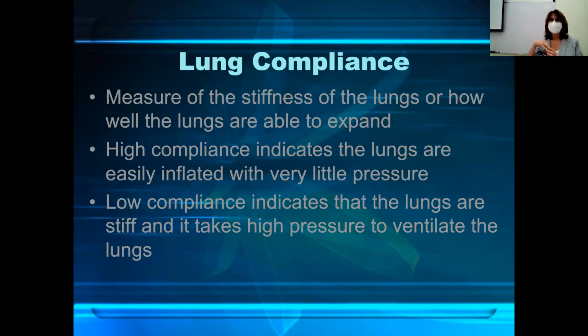So sometimes when you push a volume of air into a patient's lungs, you notice that not much pressure builds up. Maybe you'll get 15 centimeters of water pressure building up when you push the air into the lungs. The next patient, you put the same volume of air into their lungs and really high pressure builds up. So why would you have low pressure in this patient and really high pressure in that patient? It has to do with a couple of parameters, and that's what we're going to discuss now.